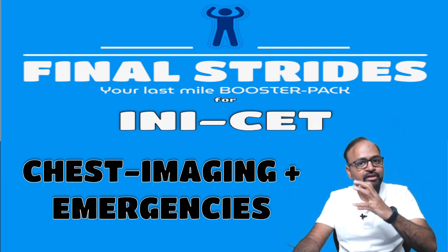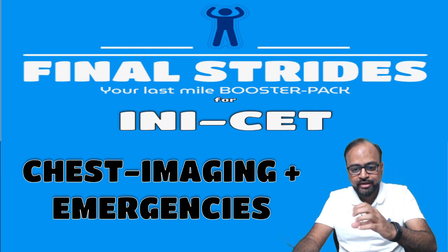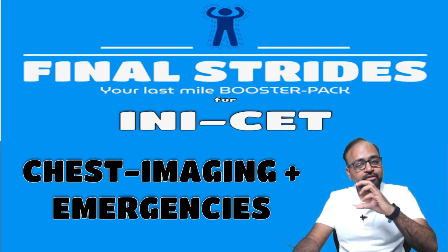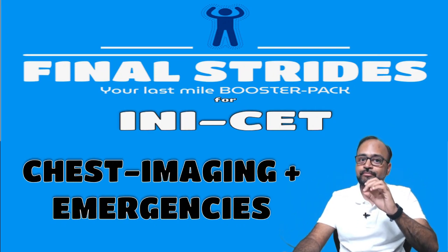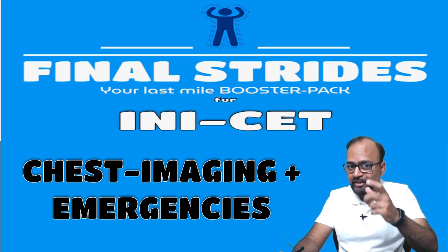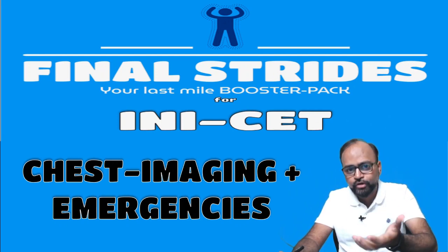And therefore today is our last final stride session and we are going to discuss probably one topic which is the most important for your upcoming exam, and that is going to include chest imaging, that is mainly chest X-rays, lung related conditions and some important emergencies. I am hoping and praying that you get at least 1 to 2 questions from this very short 15-minute session that we are going to have here in the next few minutes.